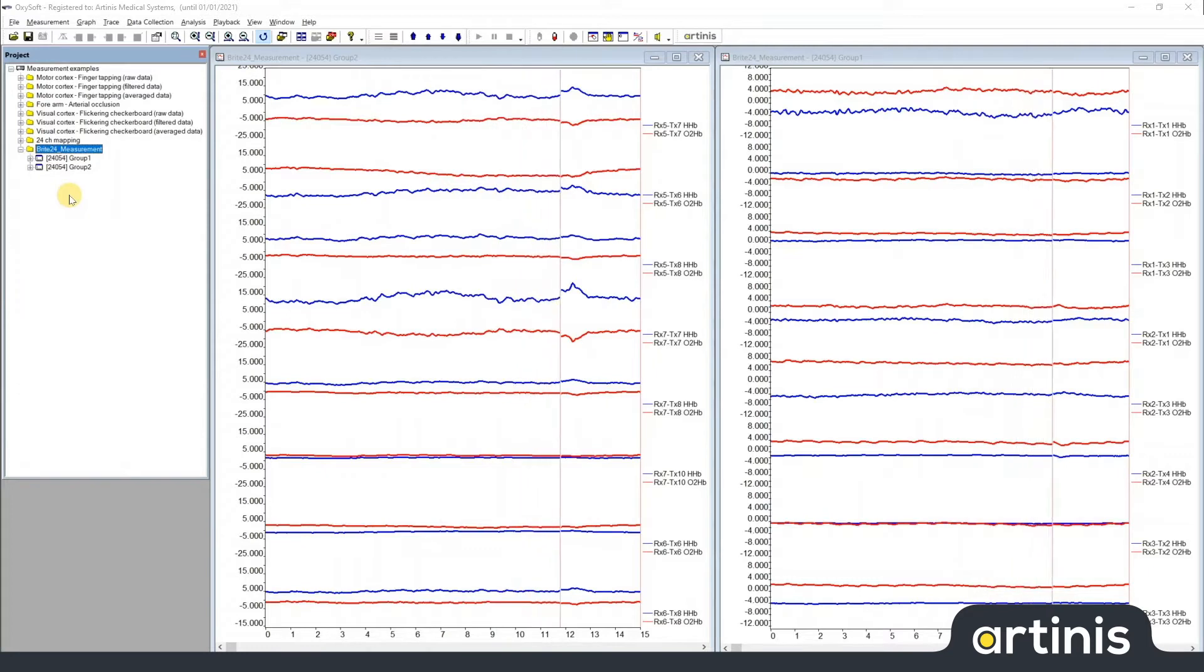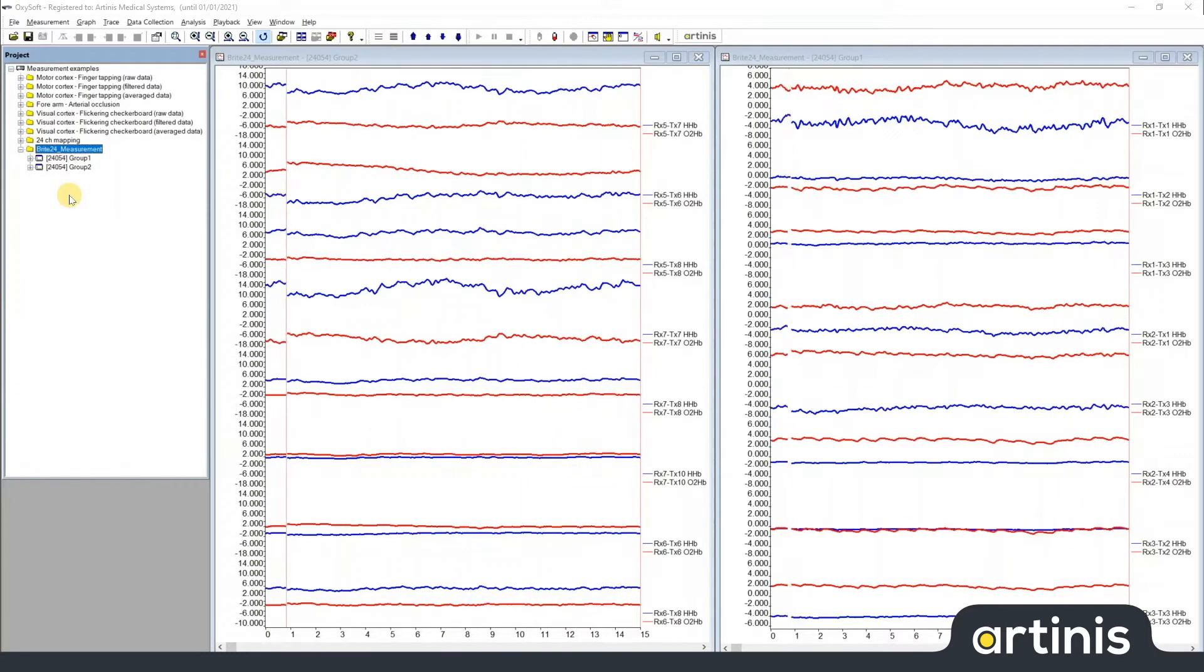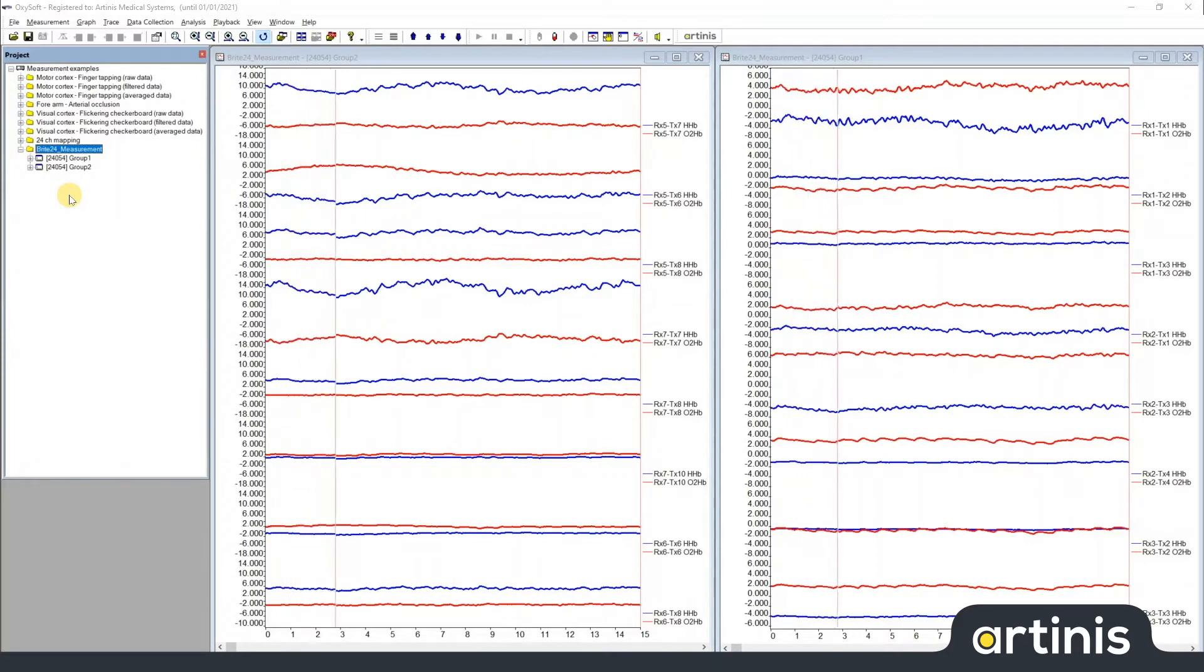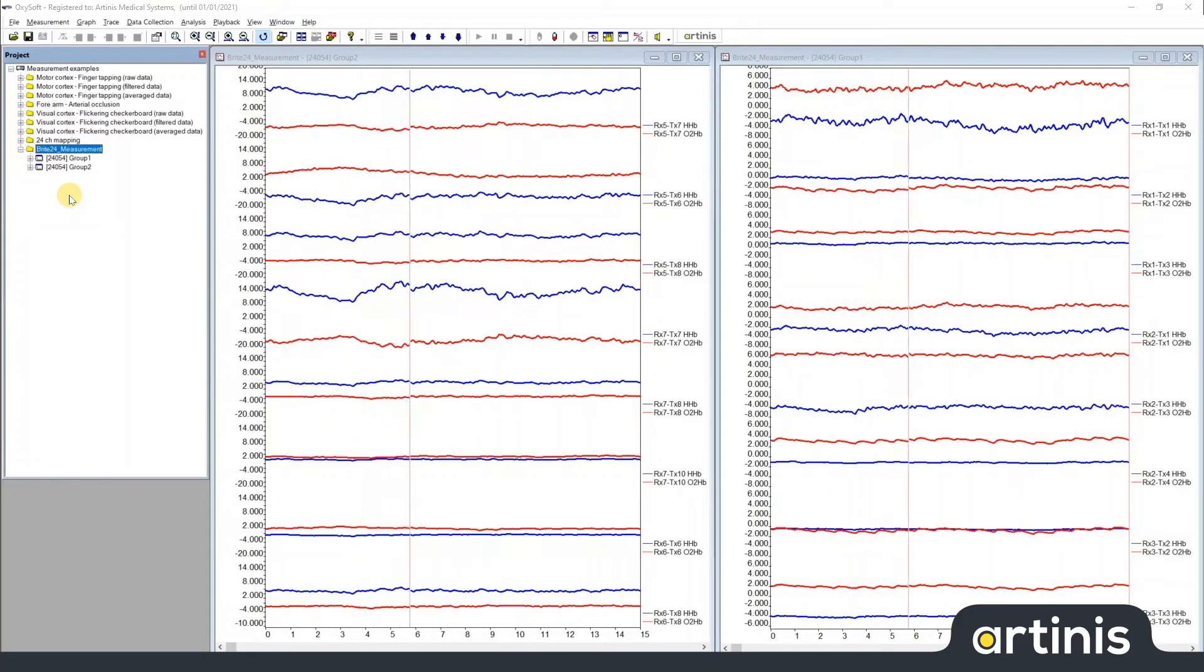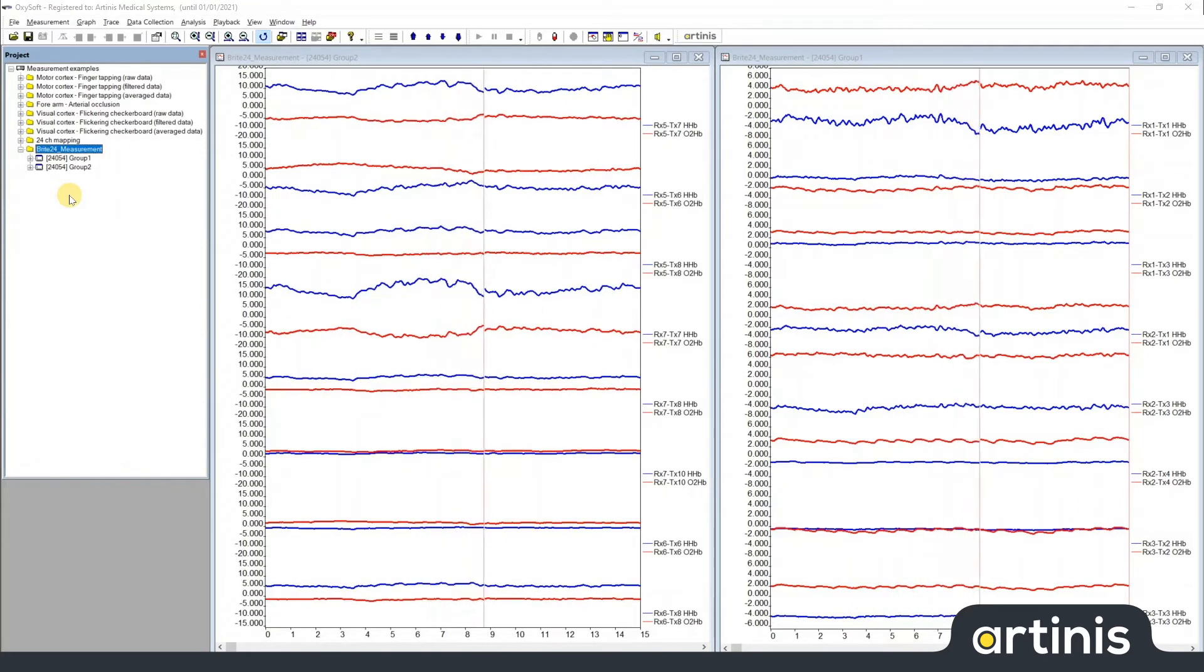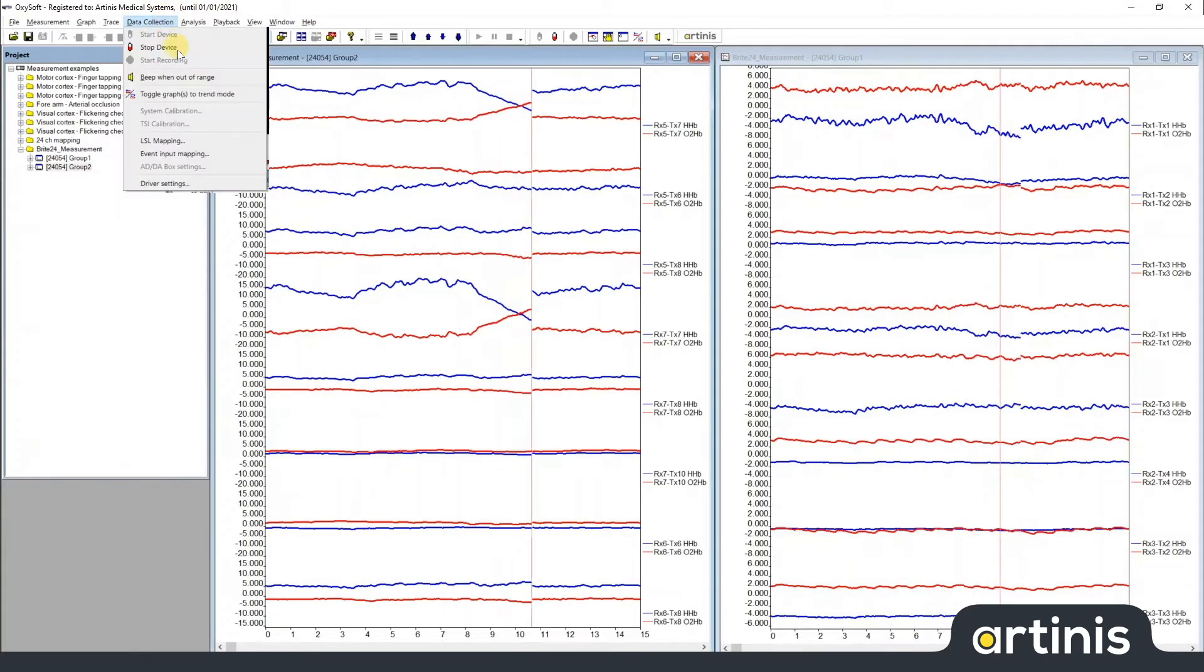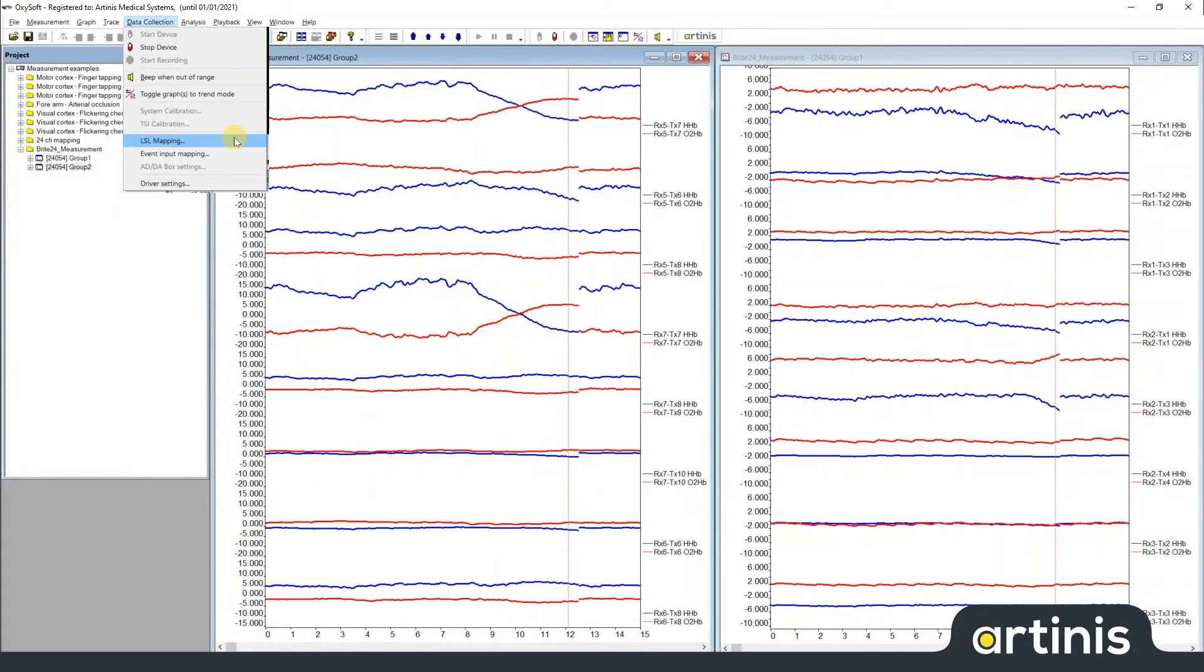Oxysoft has the capability of streaming data and events in real time using the lab streaming layer. To enable this streaming when you have a measurement running, as I do now, simply go to the data collection menu and select LSL mapping.